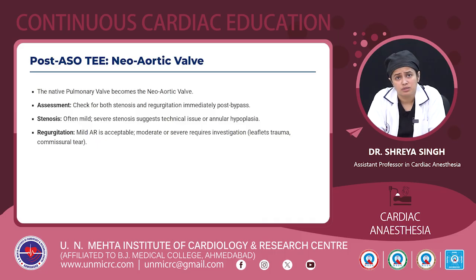Post-arterial switch operation, in the TEE we look for the neo-aortic valve. So now the native pulmonary valve becomes the neo-aortic valve. So we assess for both stenosis and regurgitation immediately post-bypass. Stenosis is often mild, and if there's severe stenosis, it suggests there's some technical issue or annular hypoplasia. And regurgitation, mild AR is acceptable, moderate or severe requires investigation. For example, it could be because of leaflet trauma or commissural tear.